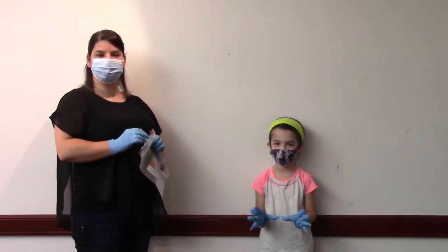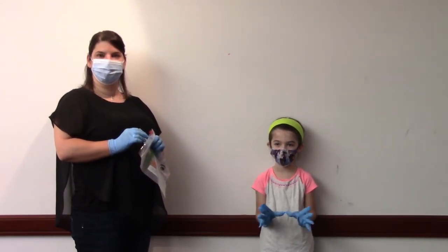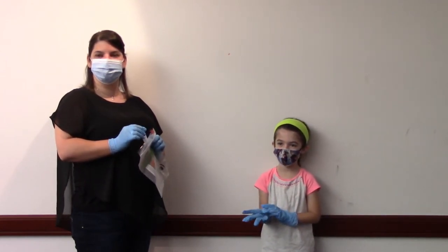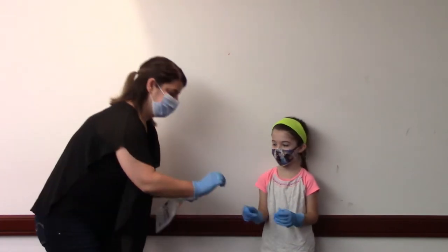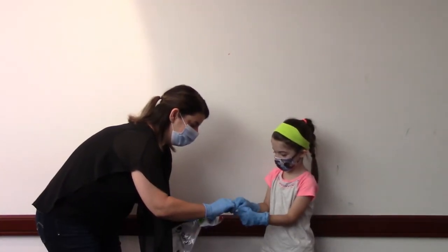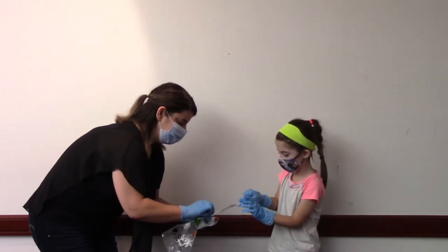This is the instruction video for the nasal swab collection by a child. The tester will give the nasal swab to the child, who will receive it in one hand, removing it from the packaging.